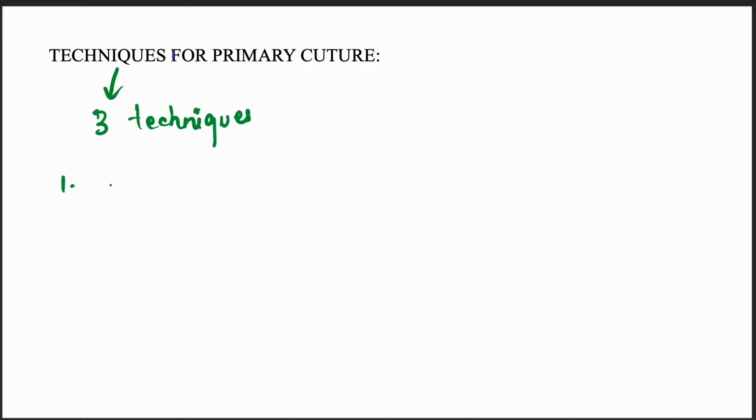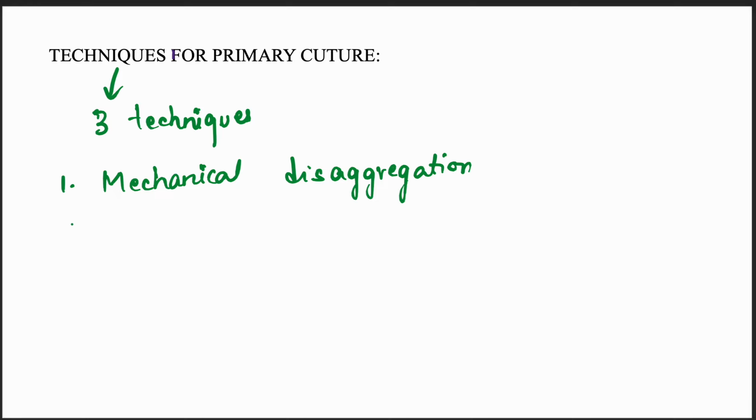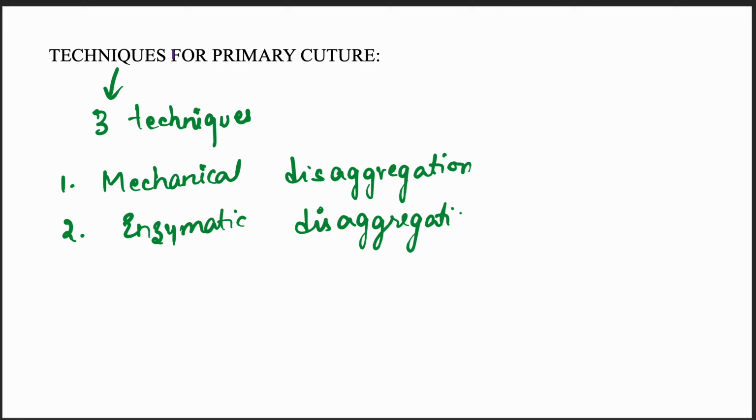First one is mechanical disaggregation. Second one is enzymatic disaggregation. Third one is primary explant technique.